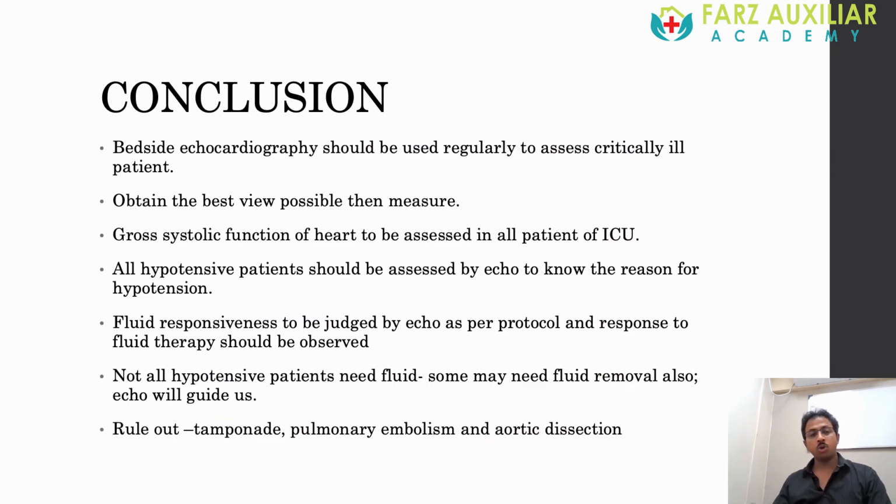Now just to conclude my talk, bedside echocardiography should be used regularly to assess critically ill patients. We have to obtain the best view possible, then we should start measuring. Gross systolic function of the heart should be assessed in all patients of the ICU, so that in a later case we can identify whether there is a drop in EF or not, or we can identify early that the patient may benefit from fluid or not.